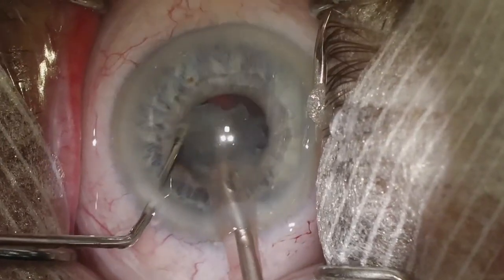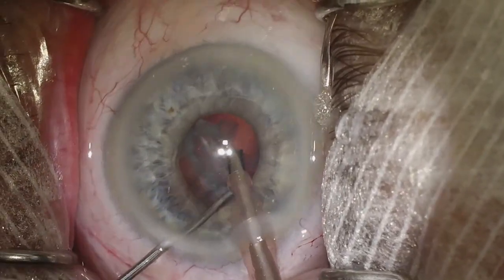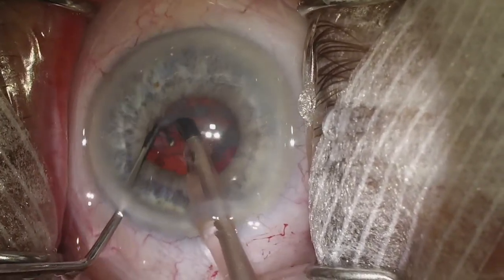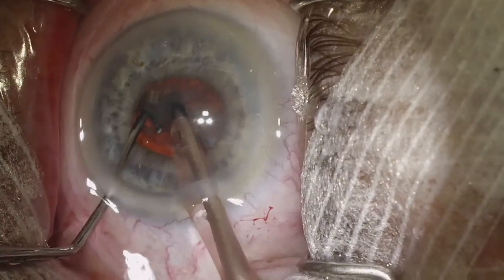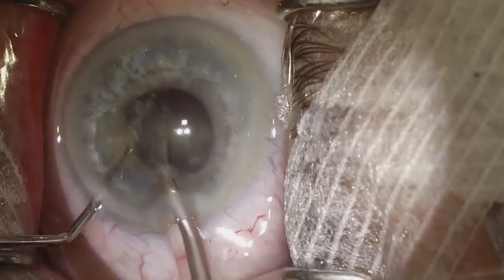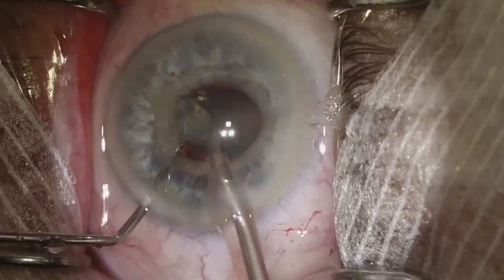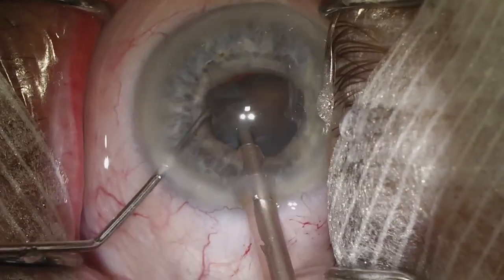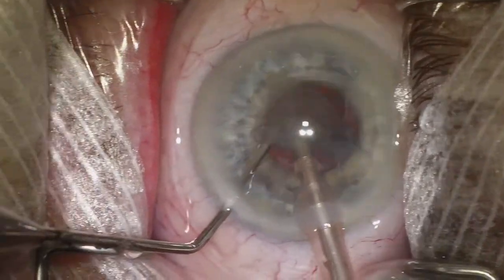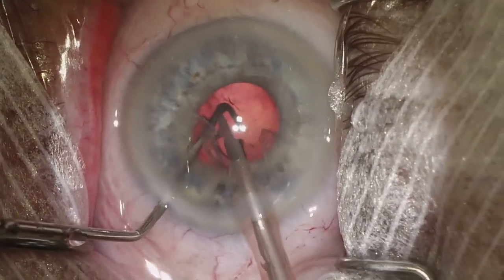It's also important that we don't capture iris into the phaco probe, especially in a patient who has a floppy iris. The iris can be quite mobile and you're already phacoing close to the pupillary margin. Now we're going to try and remove the hemi nucleus — it is obviously larger and will not tumble as well, but we're going to take our time. We may even use our second instrument to chop a little bit more. We want to keep our second instrument behind the piece continuously, and that will help keep the posterior capsule back as we do our last piece of the nucleus.